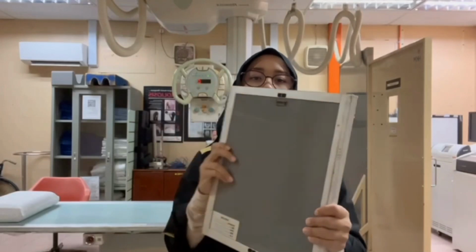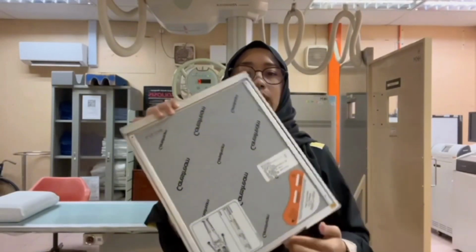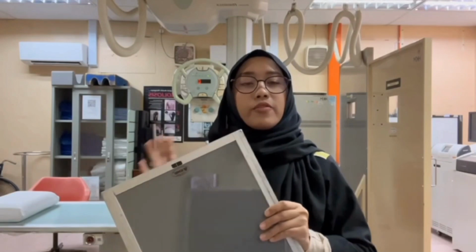Okay, nice. We have the grid. The function of the grid is to enhance the image clarity. It is used by placing it between the image receptor and the patient. So here is the grid, and the back is the cassette that I've reloaded beforehand. So it functions to absorb the scattered radiation that can blur the image. Basically, the grid usually is for skull X-ray.